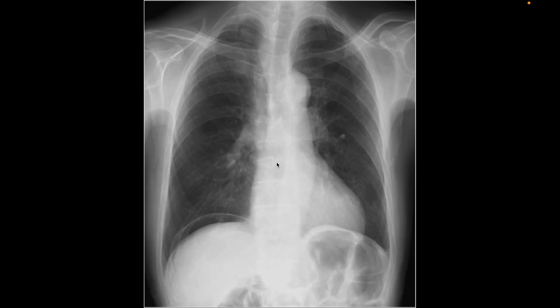This is another case where we can see subdiaphragmatic free air, which we couldn't see in normal cases, and it is the sign of hollow viscous perforation and peritonitis.